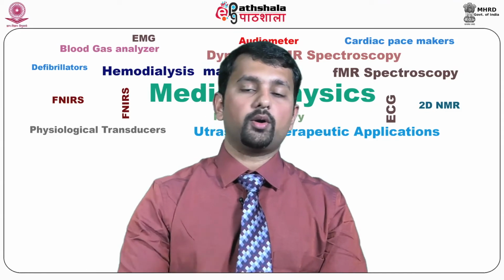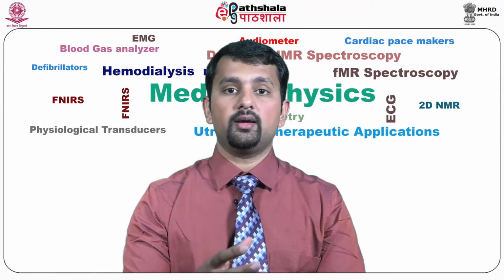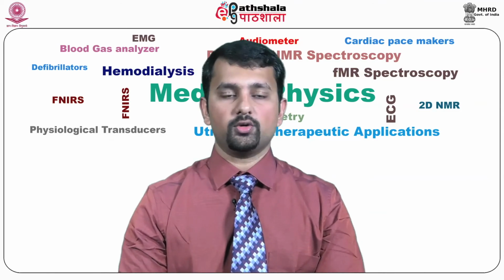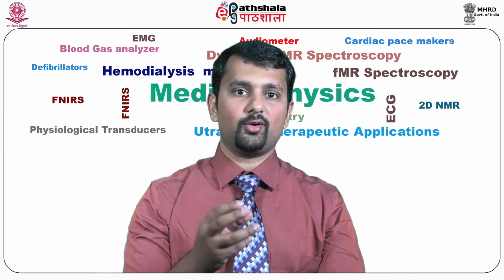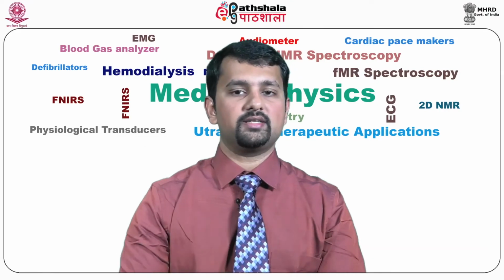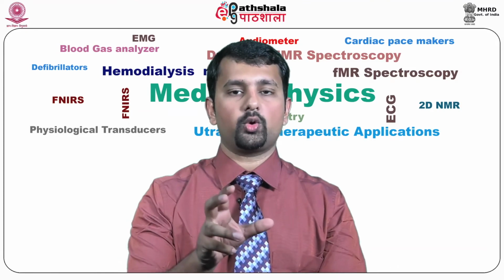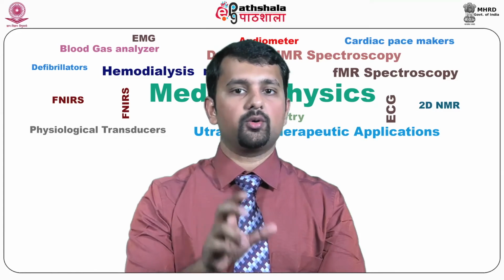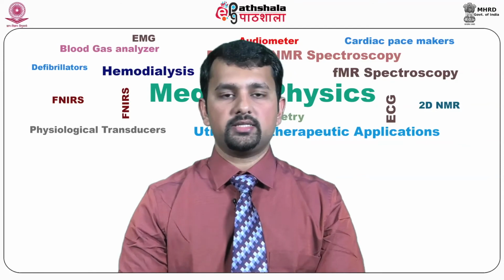So, what is more important in focal liver lesions is to assess the choline through phosphorus MRS rather than proton MRS. Phosphorus MRS is coming up in a big way to assess the choline levels in focal liver lesions as compared to proton MRS. The role of proton MRS in focal liver lesions is less, it is difficult to obtain, it is quite challenging. So, we will not go into the depths of that in this module.